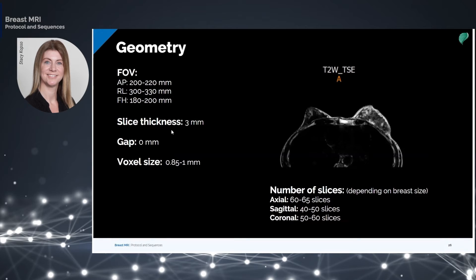Slice thickness is 3 millimeters and the gap is 0 millimeters for all the planes. This is a requirement for high-quality detailed breast MRI. If the slice thickness used was more, some small focal lesions of 5 millimeters or less would be undetectable.